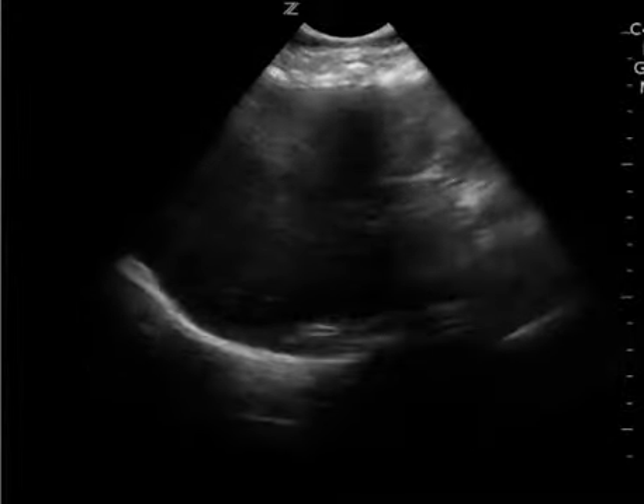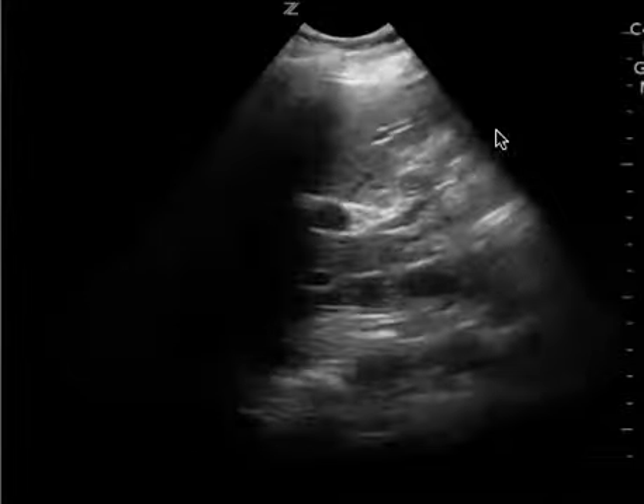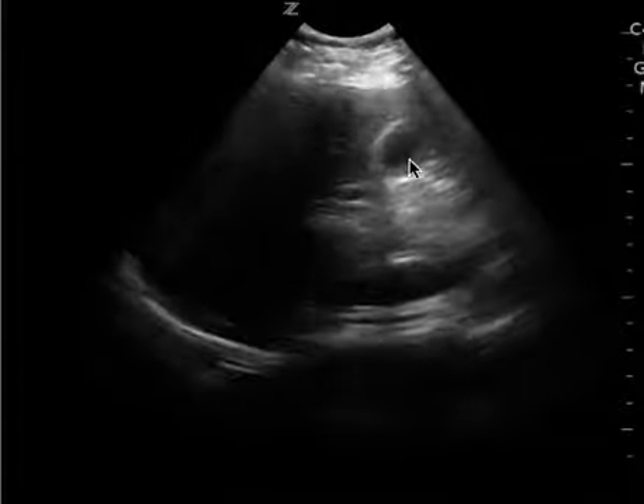This is a right upper quadrant ultrasound to look for the gallbladder. Here you have the IVC, you have the liver, and on this clip you don't see the gallbladder too well, but here I do believe you see it right here.